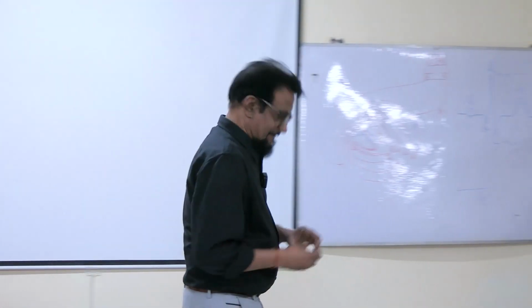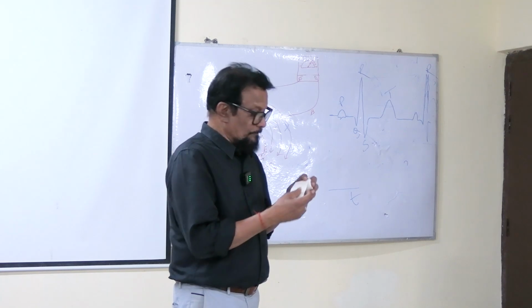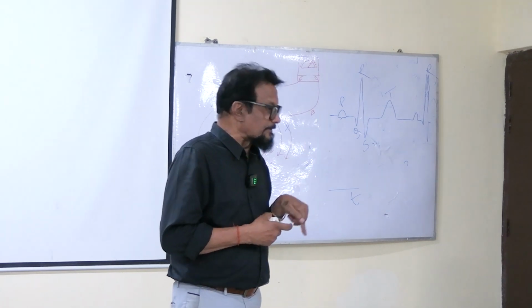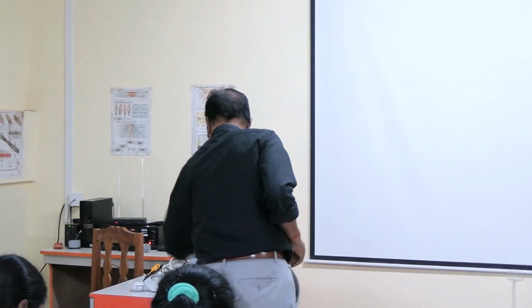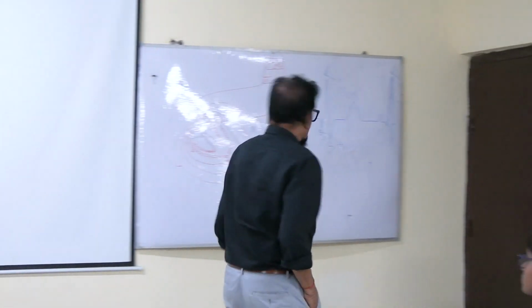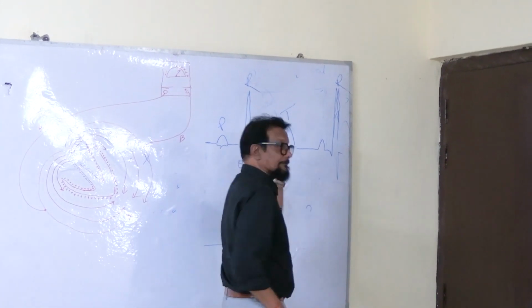In this way, this will be recorded on this paper. So, from this paper, you can determine the amplitude of different waves and the time of different waves. Understood? Next, what are the different durations I got? This is one duration, this is another duration, and this duration.